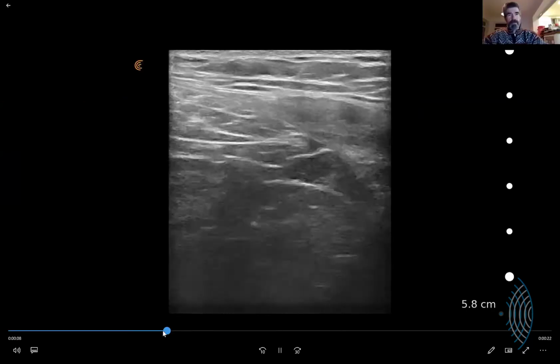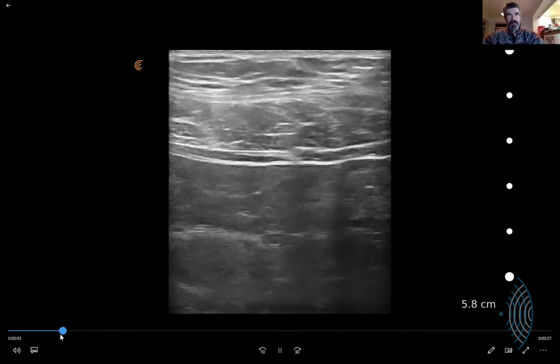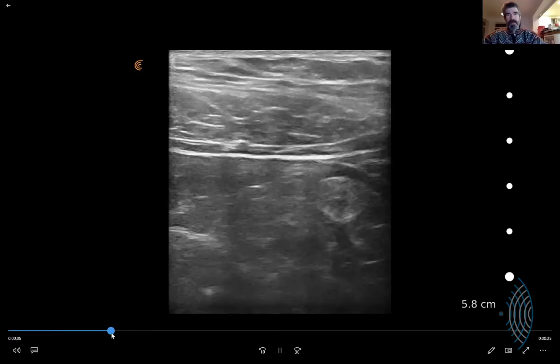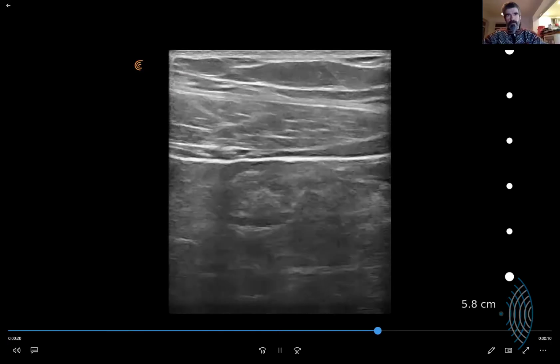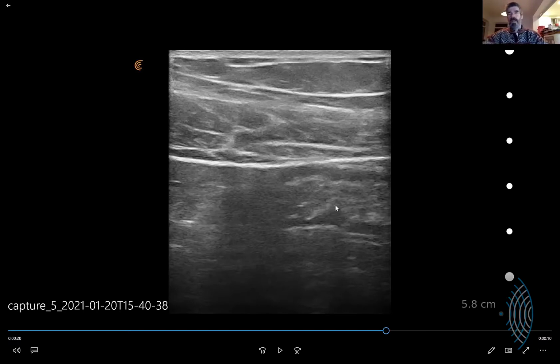So I don't know what this thing is showing up like here. Yeah. And that's now inside the abdomen. Okay. So that bowel, anytime I'm looking here, and there has not been any compromise in this white plane here, I can say that this is just incidental feces or something in some form.